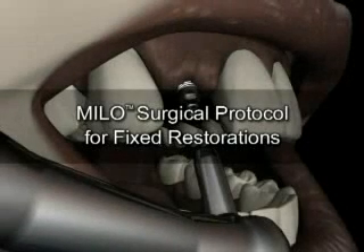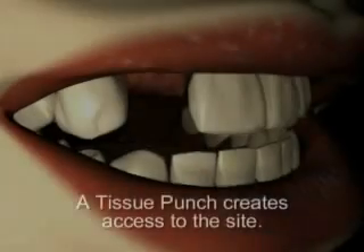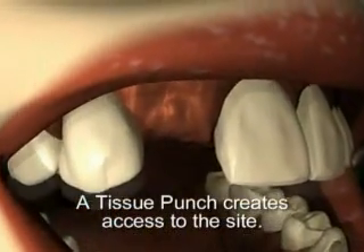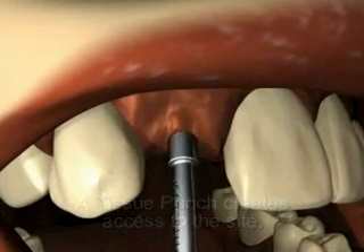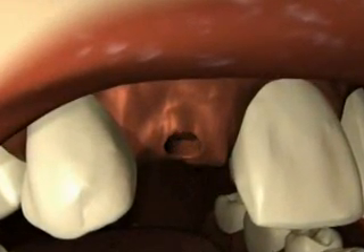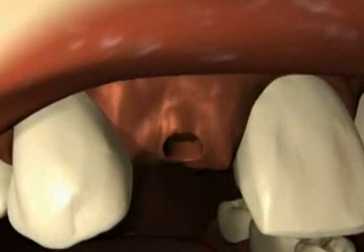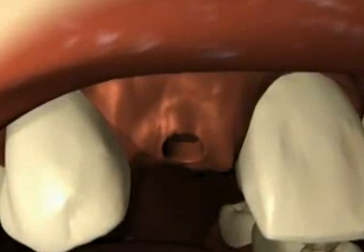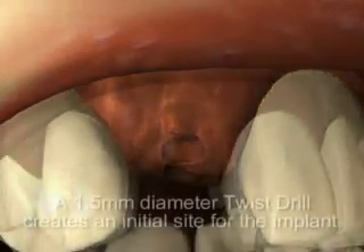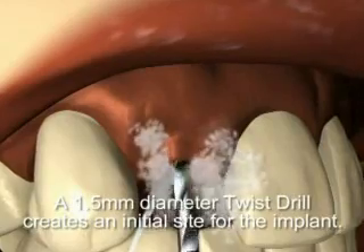These next sequences demonstrate Milo's surgical and prosthetic protocol for fixed restorations. A tissue punch is used to penetrate the soft tissue at the osteotomy site. When thin, porous, or irregularly contoured bone is encountered, or when gingival manipulation or grafting is necessary, a full thickness mucoperiosteal flap should be reflected.